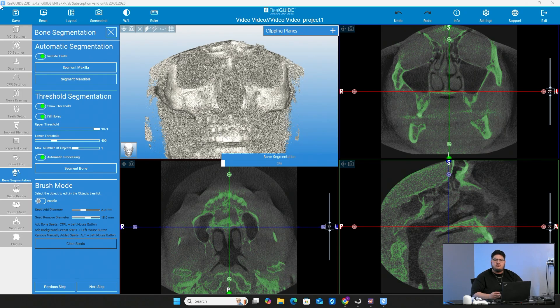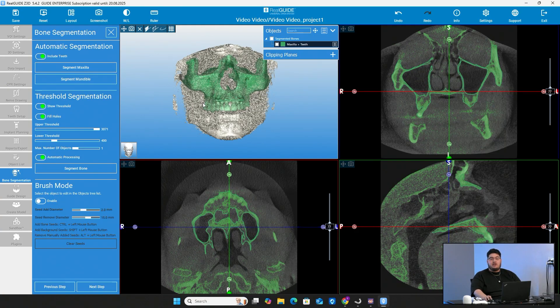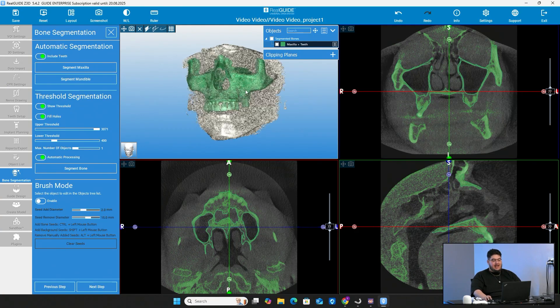It shouldn't take too long — anywhere from about two to five minutes, depending on how big the scan is and how much data there is on the actual CT scan. That will determine how long it takes to segment the bone. You should then have your segmented bone, highlighted here in green.